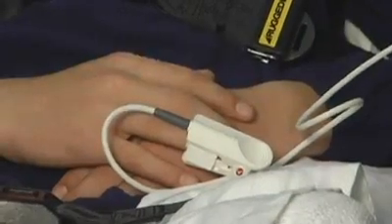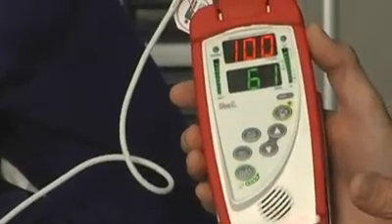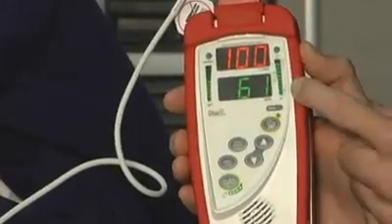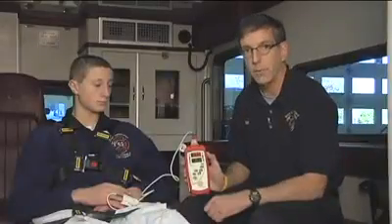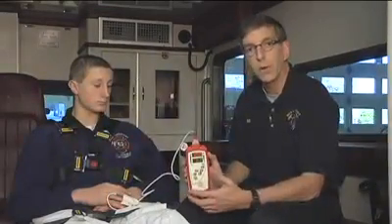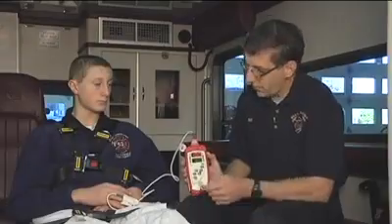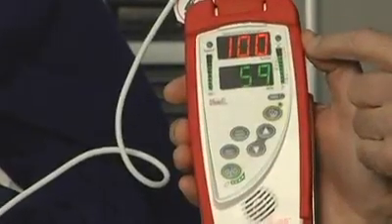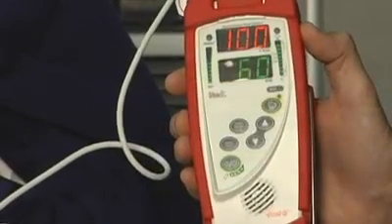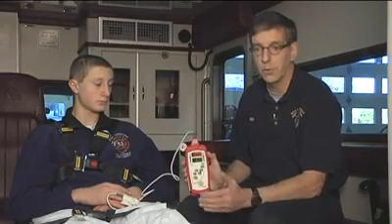On this particular oximeter, made by Massimo — as well as oximeters made by Datex Ohmeda and Philips — we have an indicator of actual perfusion called perfusion index. If you're using an oximeter that has perfusion index, in an adult patient, 1.4 is the cutoff for a reliable versus an unreliable signal. In this instance, his perfusion index is well over 4, so his perfusion to the extremity with the probe is excellent. For a neonate, 1.27 is the threshold for good versus bad perfusion.